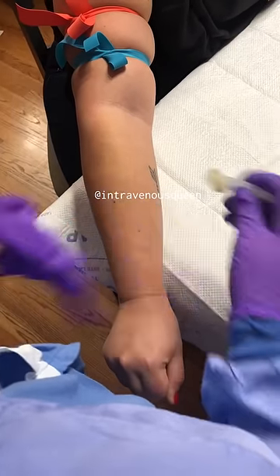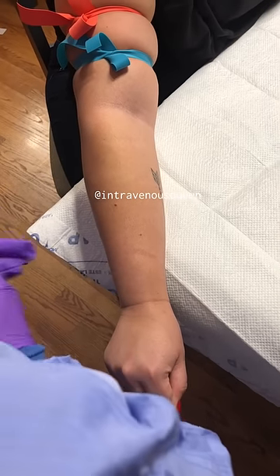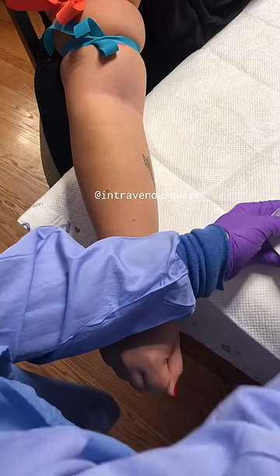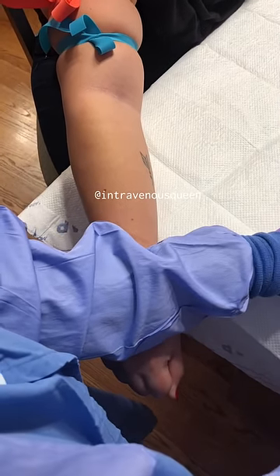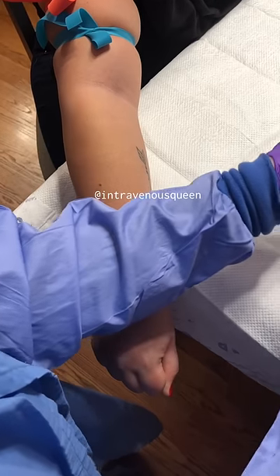It's okay to verify again without gloves on just to be sure, but make sure to clean again with either an alcohol pad or a chlorhexidine swab before you insert the needle where you touched. In this video the chlorhexidine swab dried out pretty quickly, so I'm going to clean again with an alcohol pad.